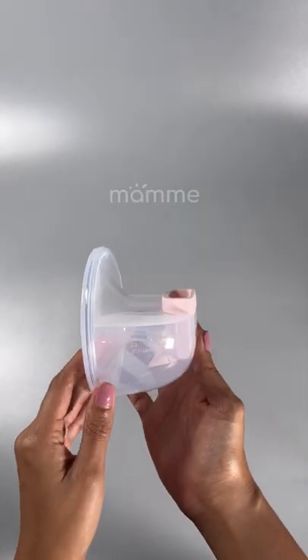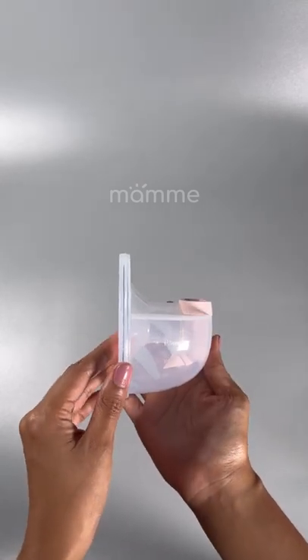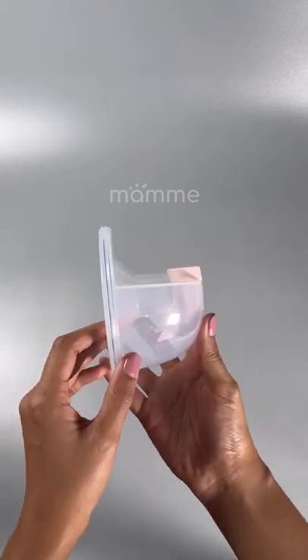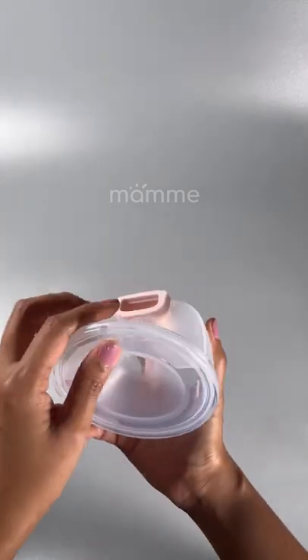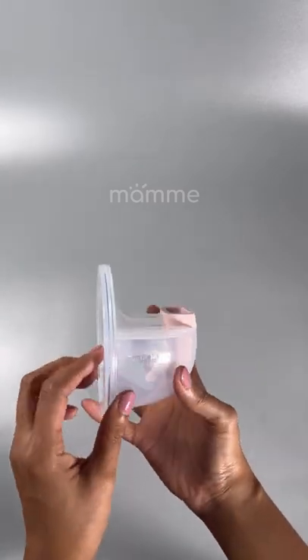Okay? How do you clean this? Wash with gentle soap and water. You can sterilize using UV steam. It's hindi naman siya ganun ka-sensitive because ang gamit, ang material na to is PP, and you have also silicone. Ayan. Just make sure that when you assemble, kailangan siya dry, well dry.